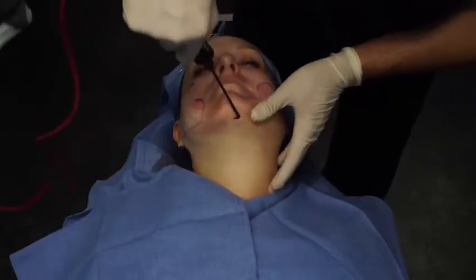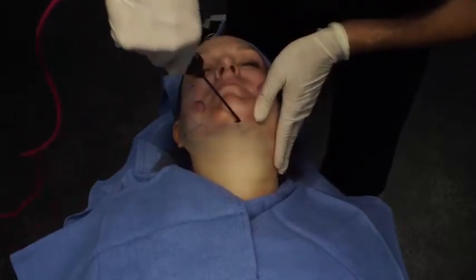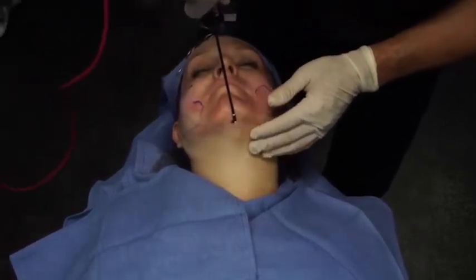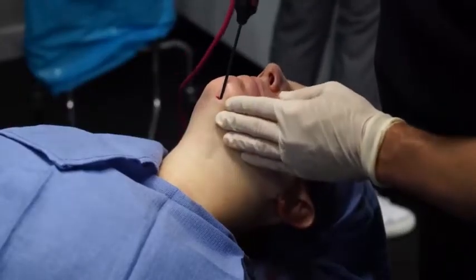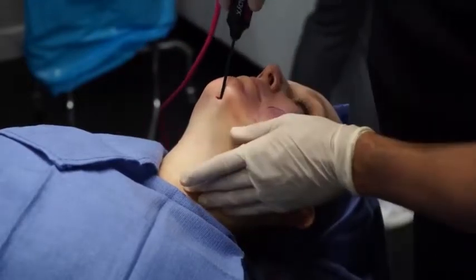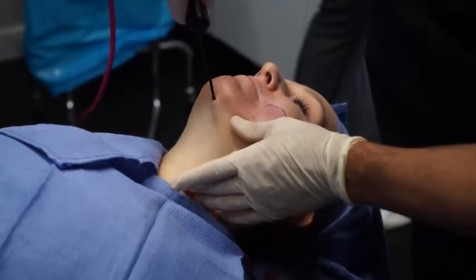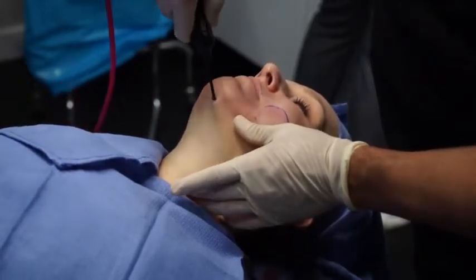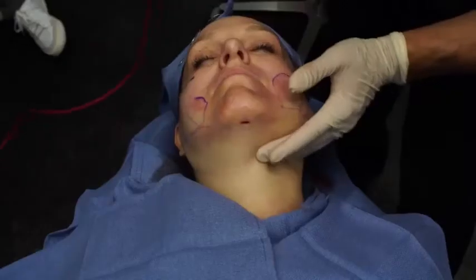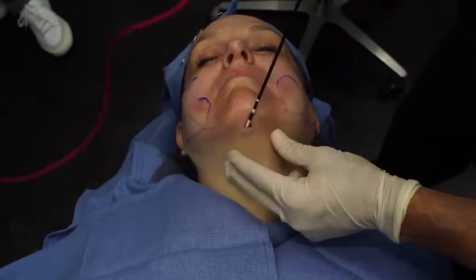advance the handpiece. We're moving at 3 centimeters per second right here in a superficial plane. Those were each individual strokes in a retrograde fashion, and this one group of strokes makes one superficial pass. We're going to go a little bit deeper here and do sequential strokes to get a deeper pass. And so notice that I'm going ahead to milk any excess gas, helium, from these passes.